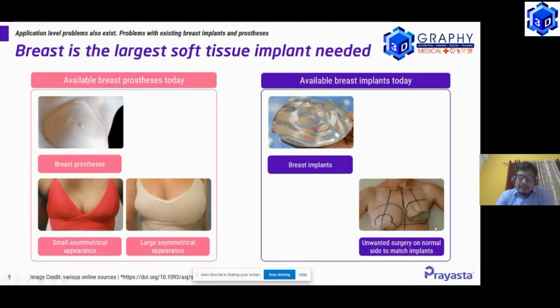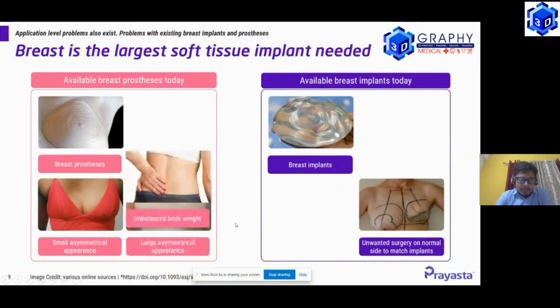For the implant side, it becomes a little worse, since implants cannot be modified in an operation theater to suit the patient. What ends up happening is an unwanted, completely avoidable surgery on the normal side of the breast, done to match the implant side. It could have been avoided if a personalized implant were available, but that is not the case today with conventional products.